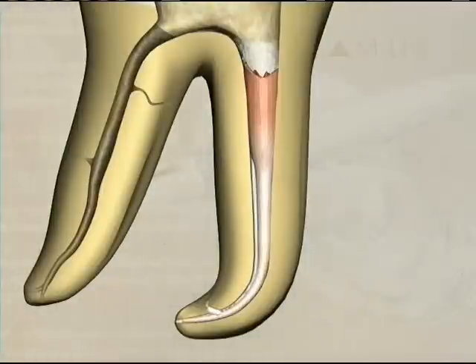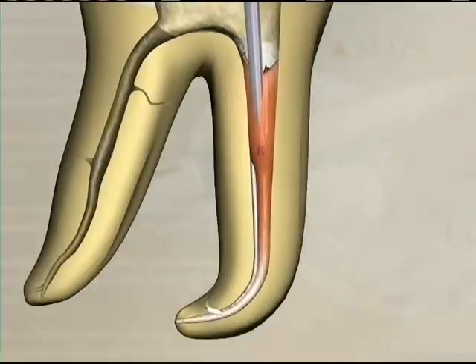In a traditional vertical condensation down pack technique, the heat carrier is inserted into the gutta percha mass a few millimeters. The change in color indicates that heat is being transferred a few millimeters down through the mass of gutta percha. The heat is then turned off and the instrument is removed.